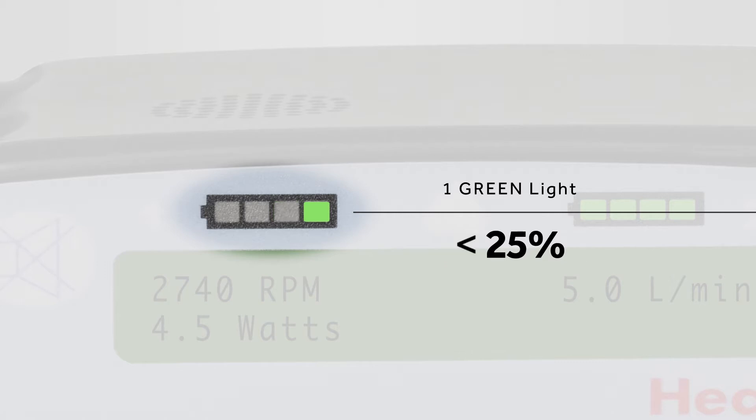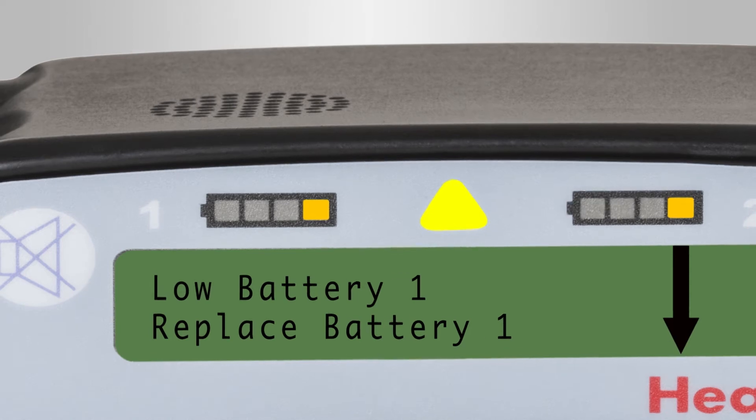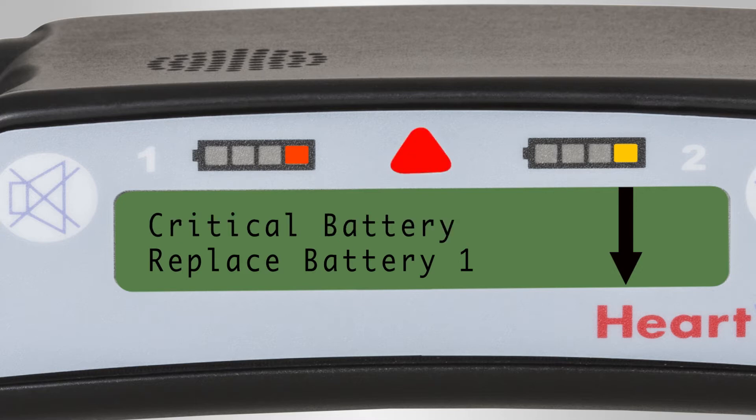When one battery is depleted to less than 25% capacity, the controller will automatically switch to the other battery. When both batteries are depleted to less than 25% capacity, both battery indicators will switch to one yellow light, an intermittent beep will sound, the alarm indicator will appear yellow, and a message will display to replace battery one. If the battery is not changed within five minutes, the alarm volume will escalate until the battery is exchanged. If a depleted battery is not exchanged, eventually a high priority alarm will sound, the alarm indicator will flash red, and the message on the controller display will read 'critical battery.' A charged battery or AC/DC adapter should be attached immediately to the power port with the critical battery indication. Never disconnect both power sources at one time.